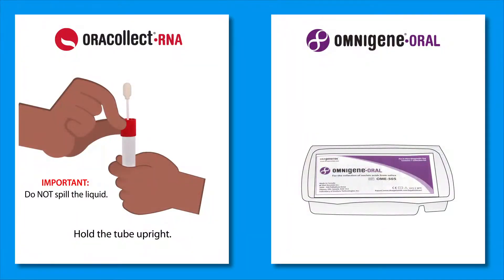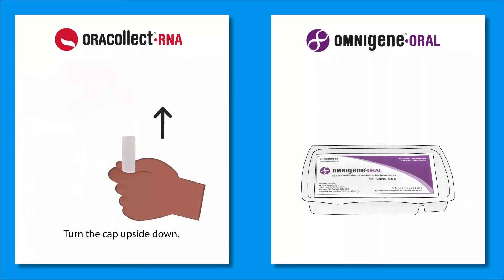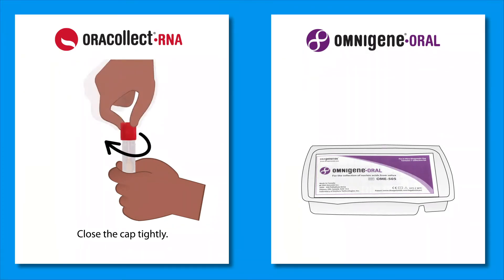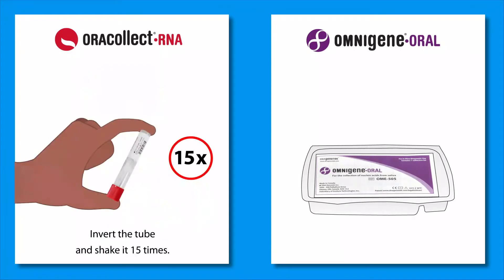Hold the tube upright to prevent liquid from spilling and unscrew the cap from the collection tube. Carefully turn the cap upside down and insert the sponge into the tube. Close the cap tightly. Invert the tube and shake it 15 times.